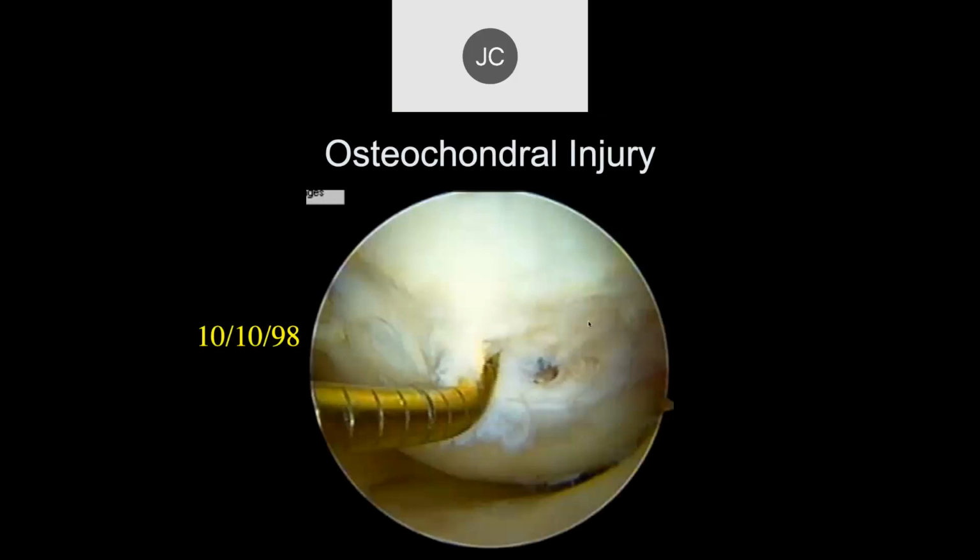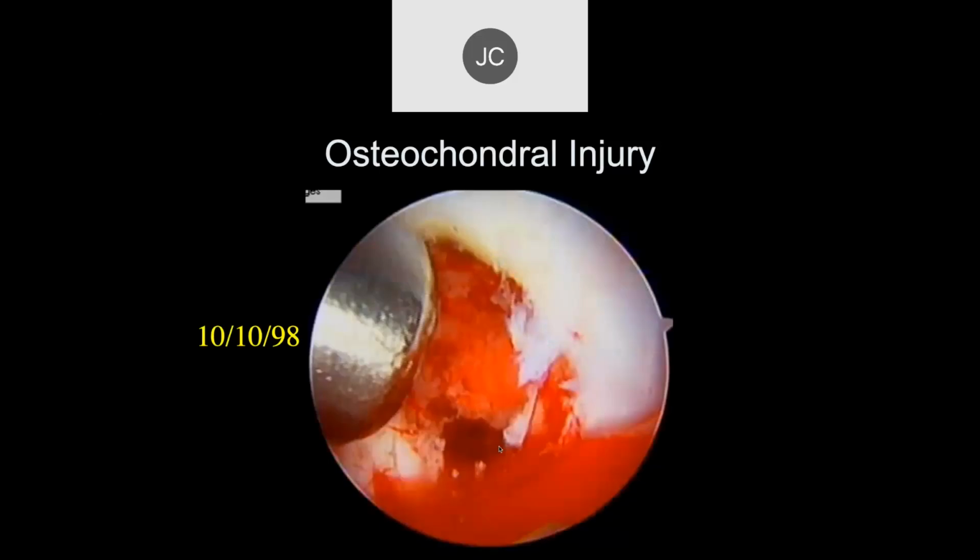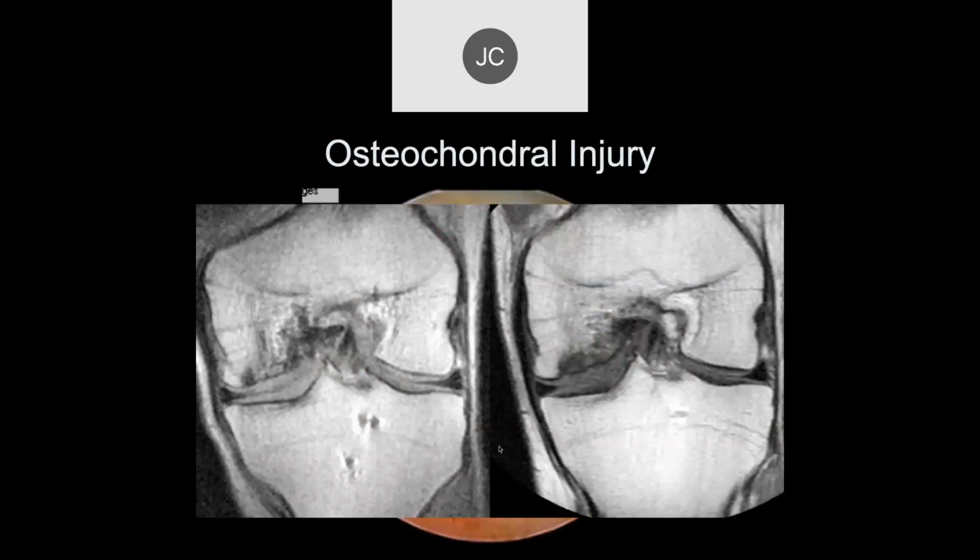We've already seen this. This is grade 4 chondromalacia. In this case, this is with the tourniquet on. They did a microfracture technique, putting little holes all through this. Take off the tourniquet and it bleeds in that area. And we already talked about this in the articular cartilage section. You can actually get a kind of fibrous cartilage that can grow in the area of the fibrin clot.